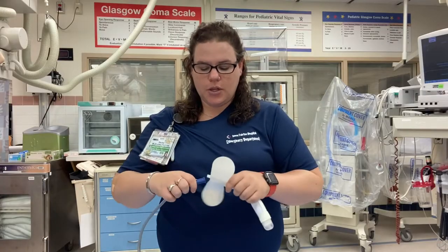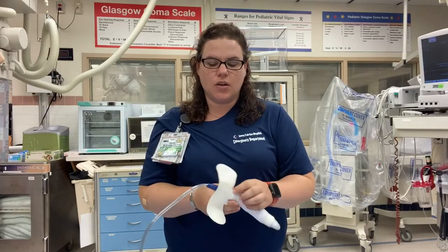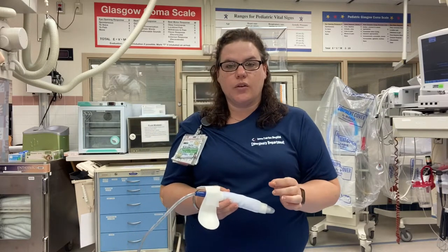After you place this on your patient, you're going to hook it up to suction tubing and put it on low continuous suction. Make sure that you check the area regularly — just because you put this on the patient doesn't mean that they didn't have incontinence issues while laying in bed. Keep in mind the patient is at high risk for skin breakdown.